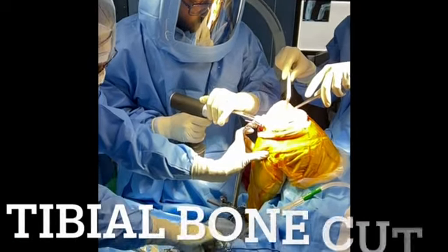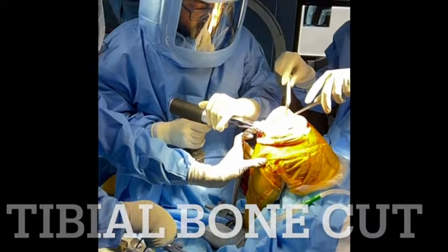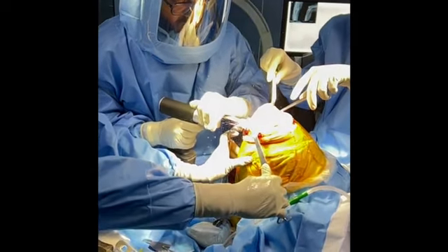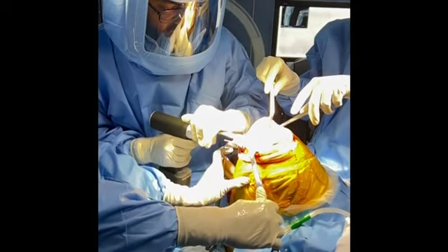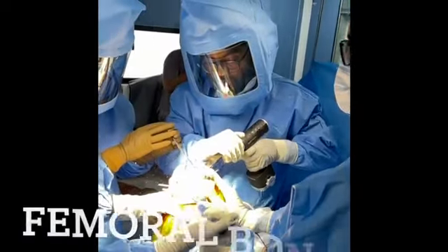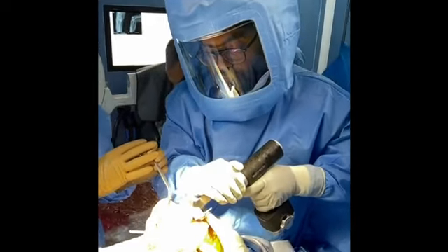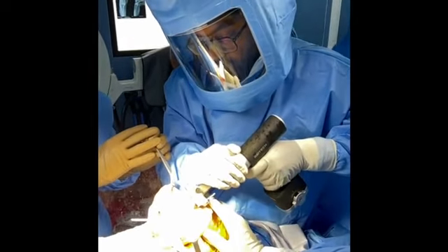Here is the video of the patient walking before the operation. During the surgery, after the soft tissue release, we usually take the tibial cut first using special instruments we usually call a jig, and after the tibial cut, we take the femoral cut. After taking the tibial and femoral cuts, we check the limb alignment and the stability of the knee joint using the trial implant and the spacers.